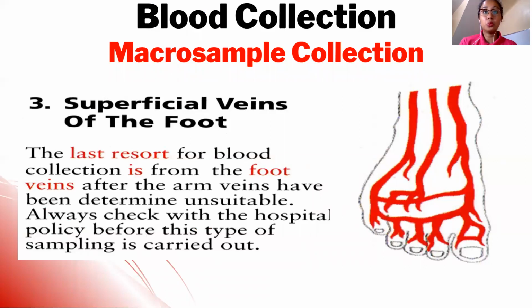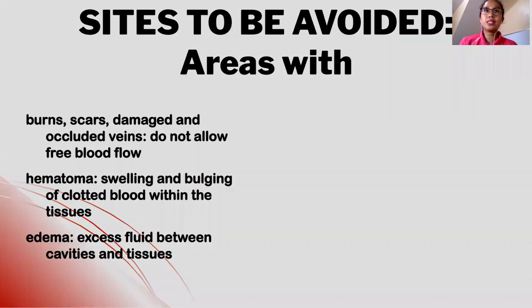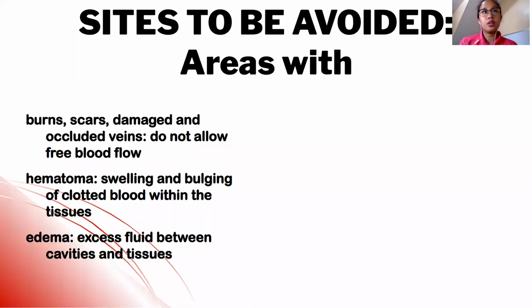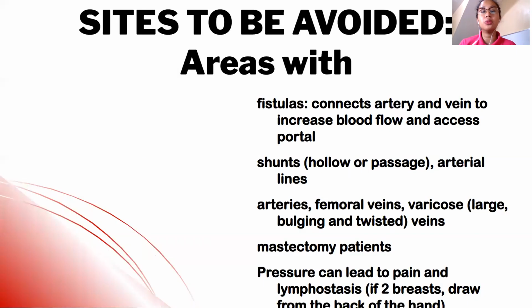Baka nag-inflict ka ng wound sa DM patient. Sites to avoid: burn scars, damaged or occluded veins, yung mga baradong vein. Hematoma, so the site was recently punctured, huwag mo tusukan doon. Edema, if there is excess fluid under the tissue, huwag mo kuhanan kasi tissue fluid lang makukuha mo.